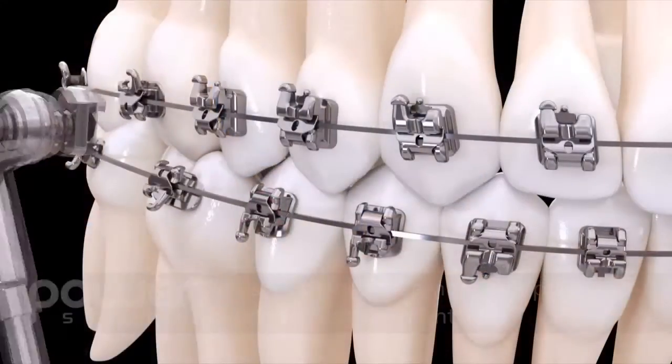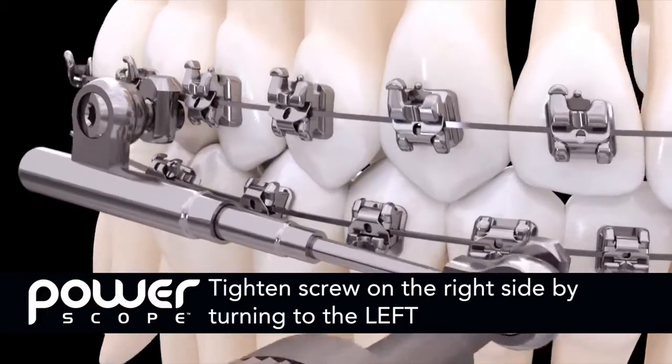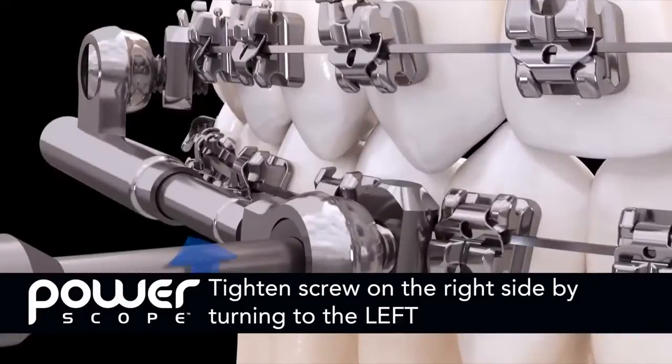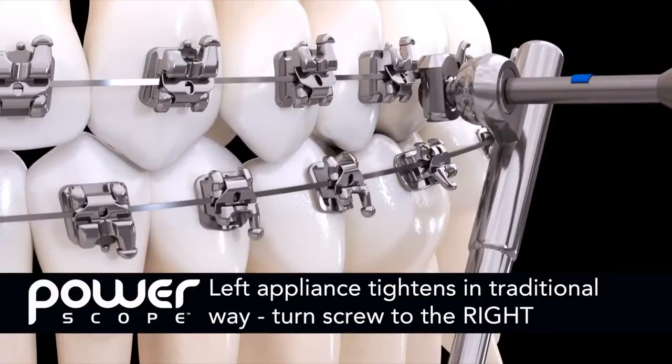It is extremely important to note that the right-sided PowerScope uses a reverse thread assembly on both the upper and lower attachment nuts. So you tighten the screw by turning to the left. This helps avoid screw back out during treatment. The left-sided PowerScope tightens in the traditional way by turning to the right.